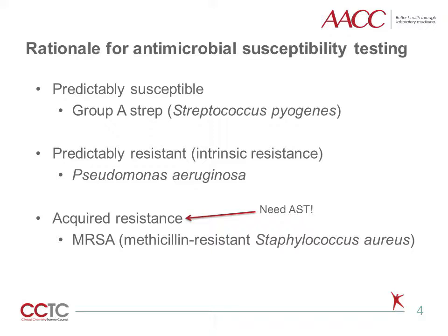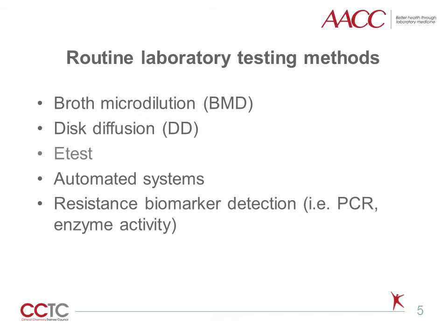In order to assess whether an isolate has an acquired resistance to a particular antimicrobial agent, an in vitro antimicrobial susceptibility test is performed. This typically involves exposing the isolate to a panel of antimicrobial agents, usually antimicrobials in the hospital formulary, and determining at which drug concentration growth is inhibited for each of the drugs tested. The results of the susceptibility test will provide guidance to clinicians on which drugs to use, which to avoid, and which to alter the normal dosing regimen for successful patient outcome. This is a routine service provided by the microbiology laboratories.